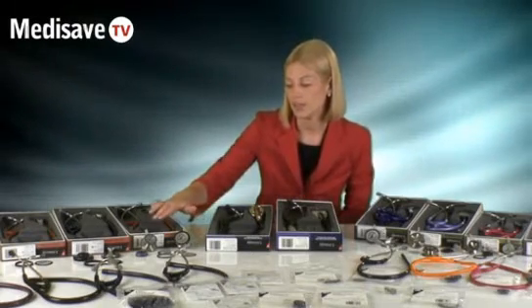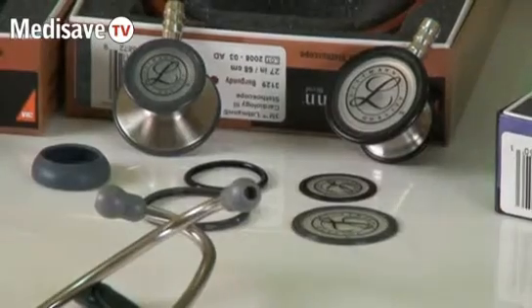Furthering this, I'm going to talk about the Cardiology 3. You'll see that there is a wide range of spares and every part may be replaced.